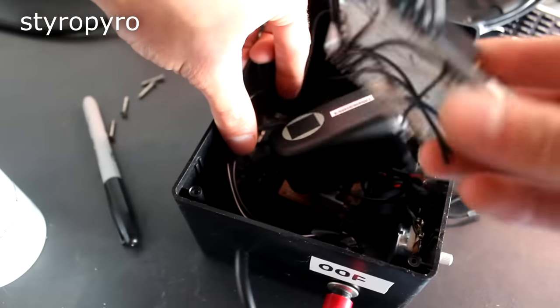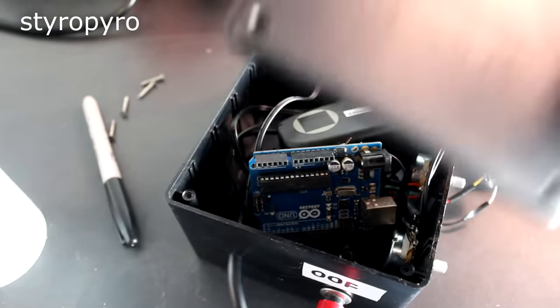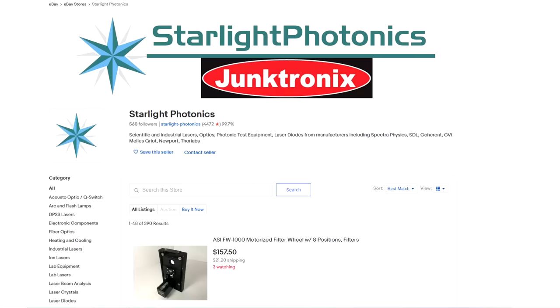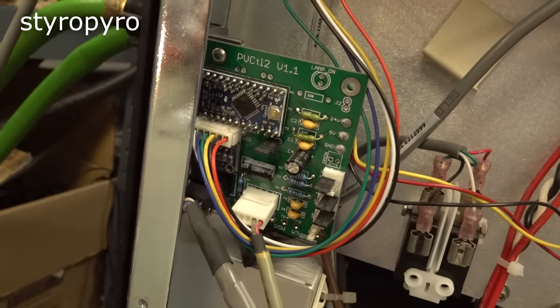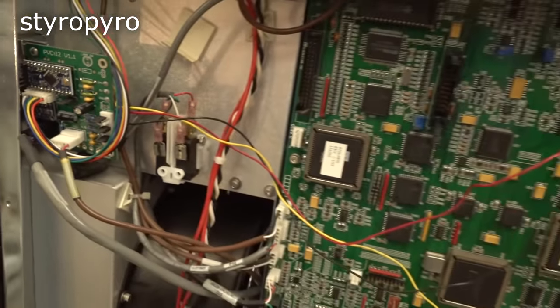I don't exactly get along with digital electronics, but thankfully I knew just who to ask for help with this. My friend Kevin, who's the owner of Starlight Photonics, has spent considerable time reverse engineering the surgical laser and has even developed a board that overrides the original controls. I bought one of these boards from him and sure enough it worked super well — I just had to solder a few connections and after that I had full control over the system.